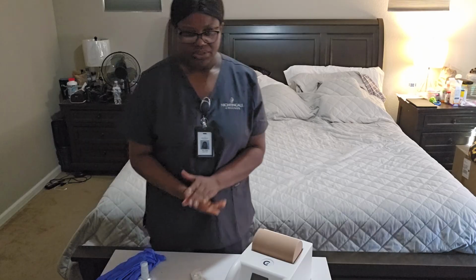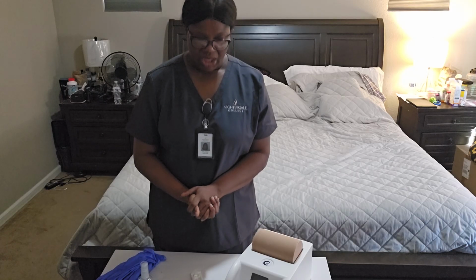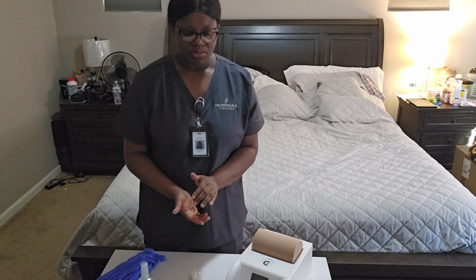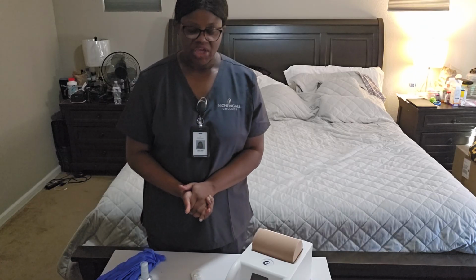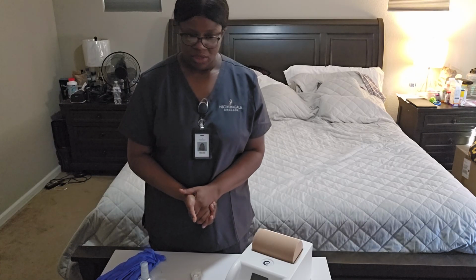Okay, Mrs. Me, today I'm going to be giving you an injection. This injection is called tuberculin. The injection is checking to see if you have tuberculosis, if you've been exposed to tuberculosis.